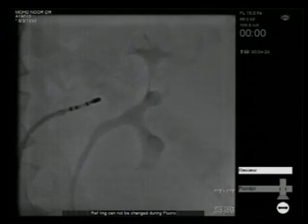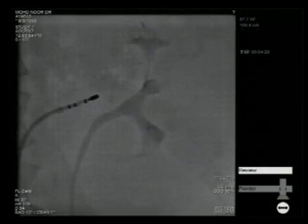You see in the other screen, that is the scout angiogram. First we have taken it to see where the distal bifurcation of the polar arteries is. We are starting the lesion just proximal to that. Dr. Narasimhan, can you just show the renal artery pictures? Can you run this renal artery here?